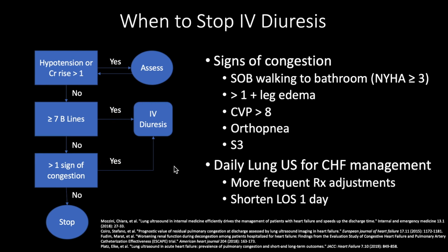So daily lung ultrasound for CHF management has been proven to allow more frequent medication adjustments and shorten length of stay by 1 day, as opposed to just ultrasounding the patient when they first come into the emergency department and maybe before going home. If you ultrasound their lungs and IVC every day, you'll recognize patients that are dry more quickly and actually can discharge them sooner more often.